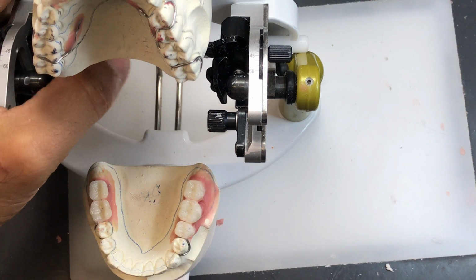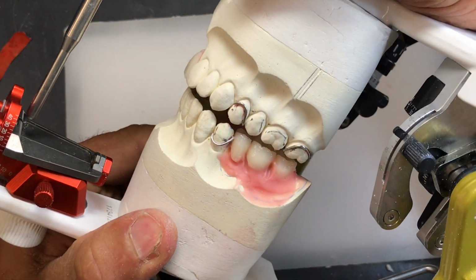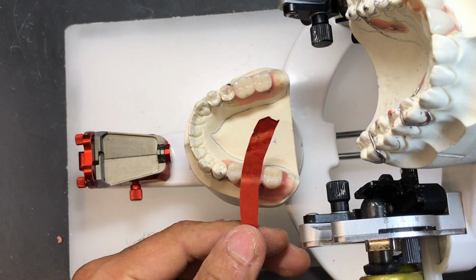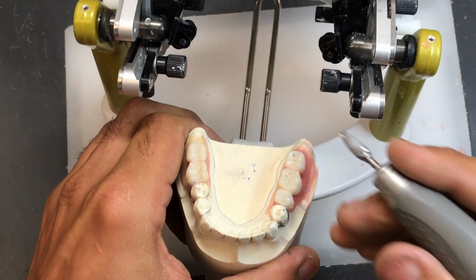Okay, I'm just going to air chill this a little bit. Normally I will let this cool a little bit longer, but just for the sake of the video, I'm just going to move ahead a little bit. And I'm going to use the very thin strip of articulating paper. And there we can see a premature contact.